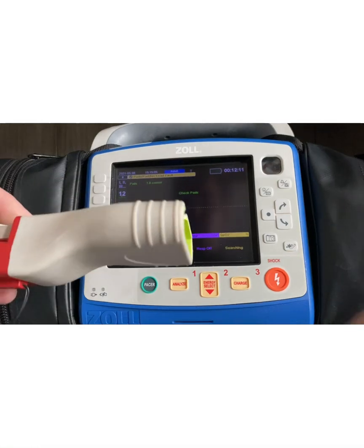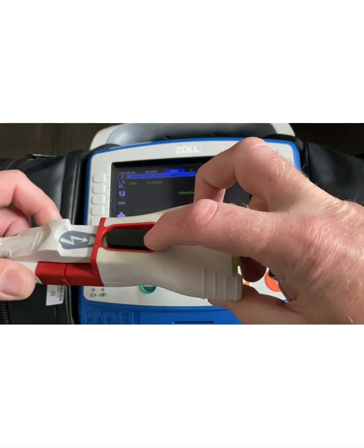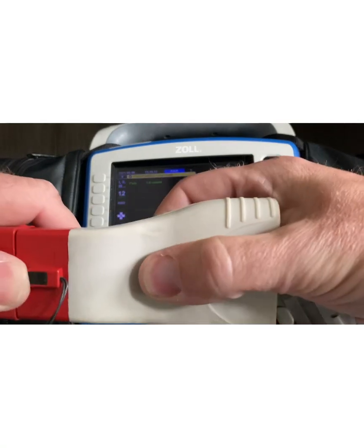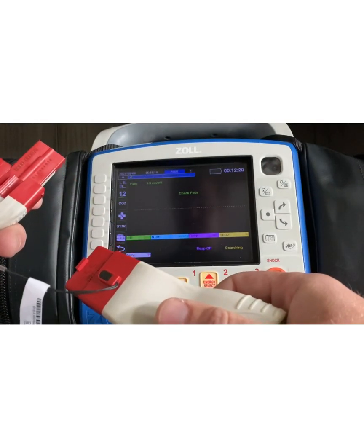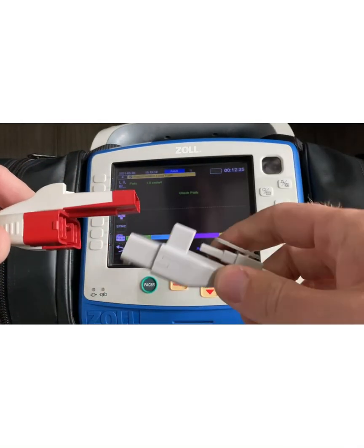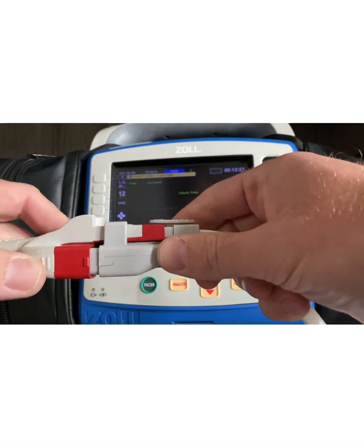So in that situation, I remove this adapter. I'm going to press down on here, take my thumb, push on here, and separate those two. This cable now is able to accommodate the one-step cable connection.